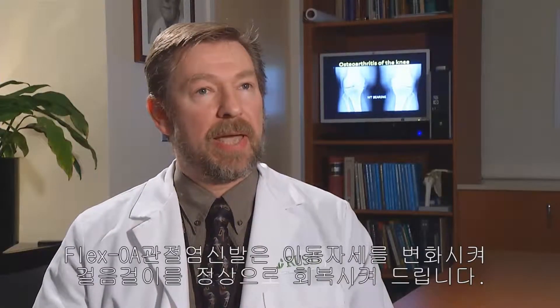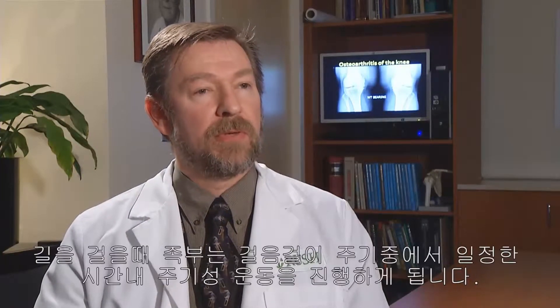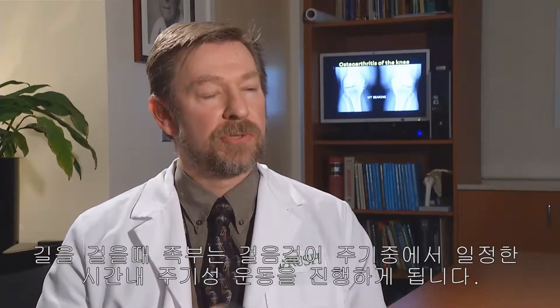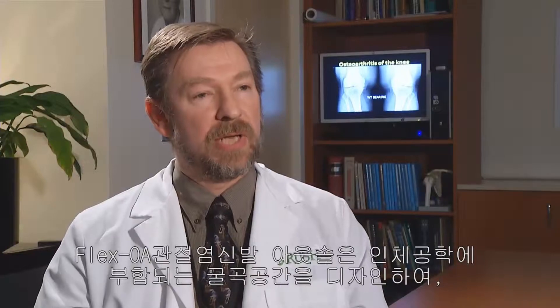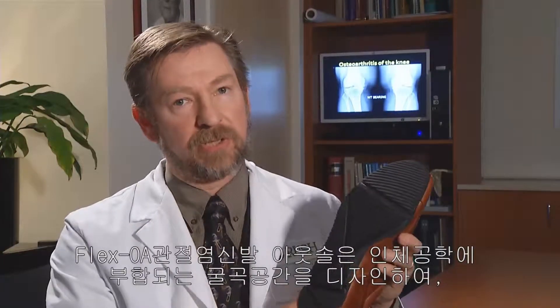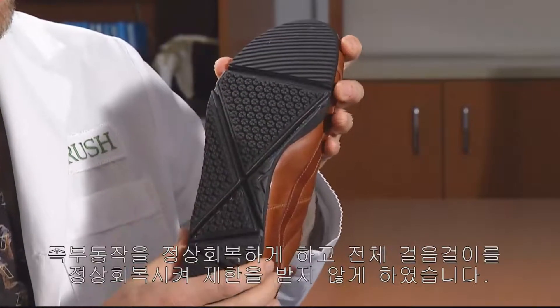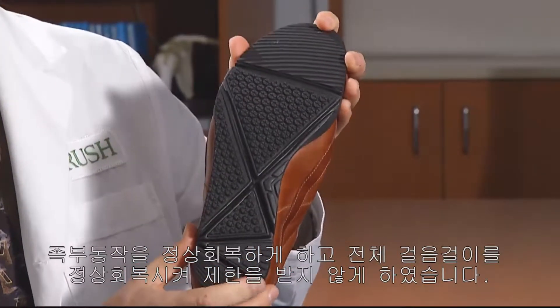The Flex OA shoe works by actually trying to allow normal motion to occur. If you think about walking, your foot has to go through certain amounts of motion at certain times in the gait cycle. What the Flex OA shoe does is it actually puts flexure zones in the outsole of the shoe and tries to allow the foot to go through its normal motion, therefore allowing that motion to occur and not restricting any of it.